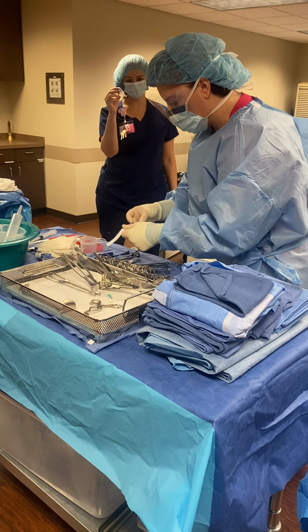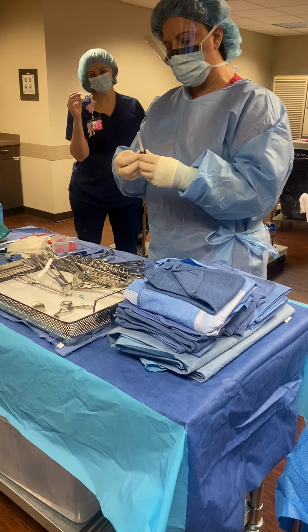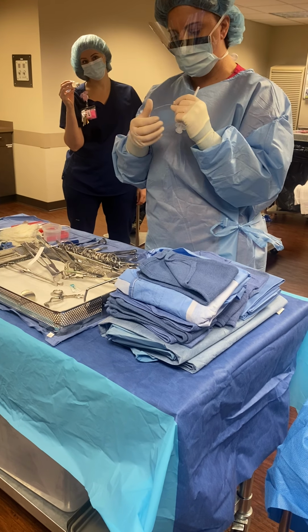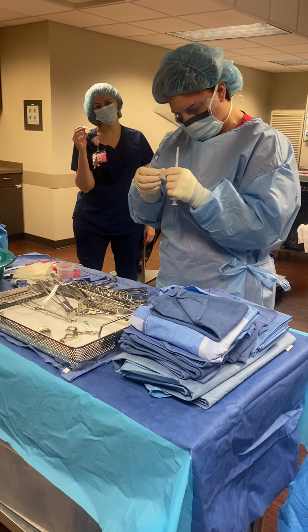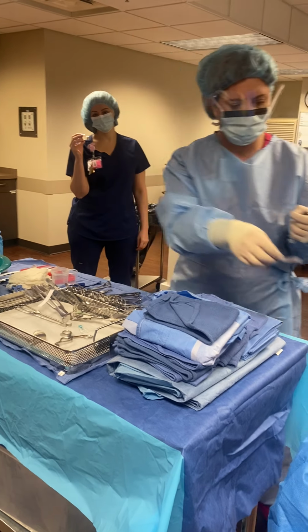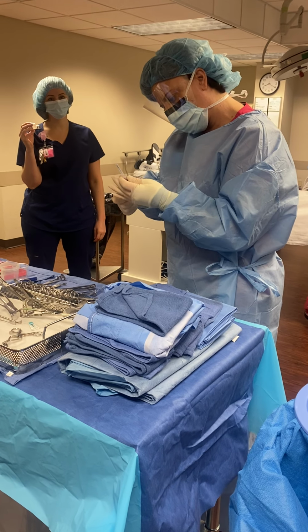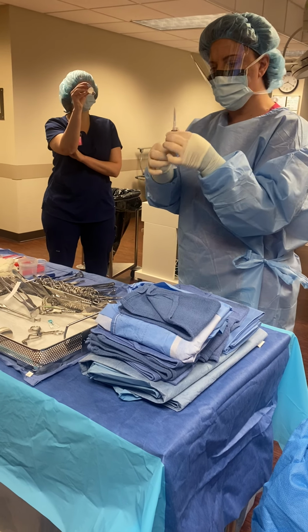8/21. Okay. Got that. And then just a little cheat code: put your label where it's not covering up your numbers. What happened was, what's going on here? Okay, it sticks better when you take the back off. Okay, just on there. And that way you can still see your numbers because you'll have to read off from them later, right? Mm-hmm.